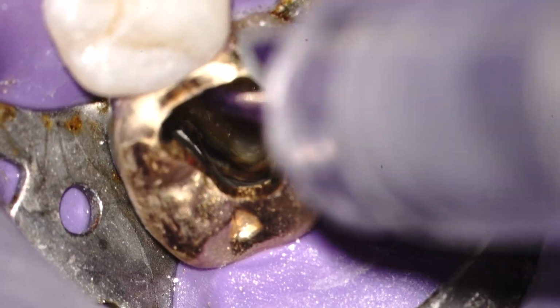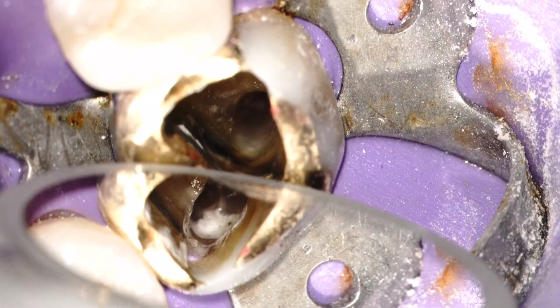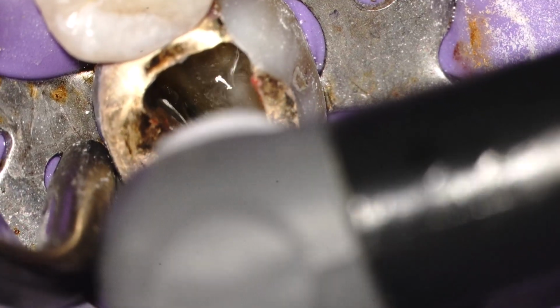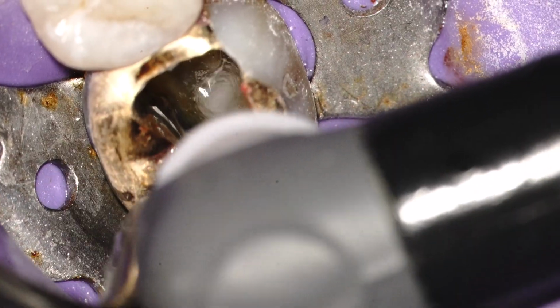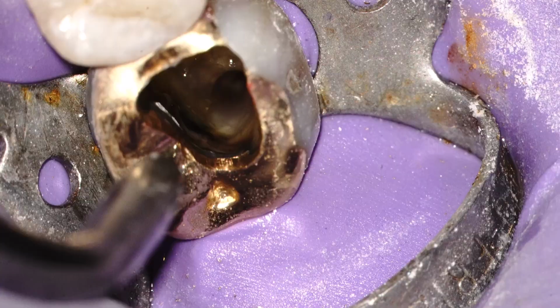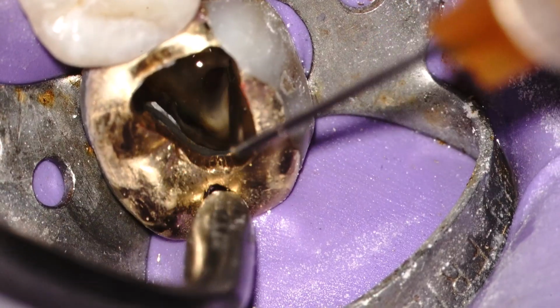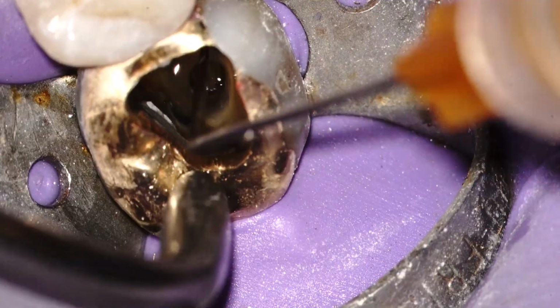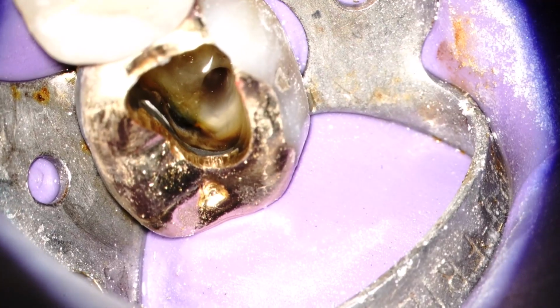Now I'm using the microsuction to evacuate the fluids from the canals and pulp chamber. Next, I irrigate with 17% EDTA and agitate each canal with the EndoActivator for 30 seconds. I edited the 30 seconds at each canal for brevity. I finally use alcohol again to flush the canals and dry before using paper points.